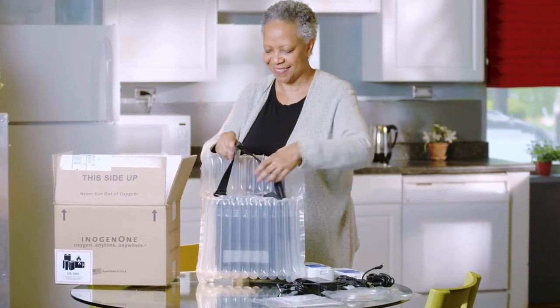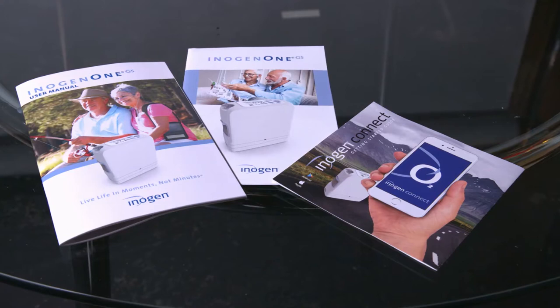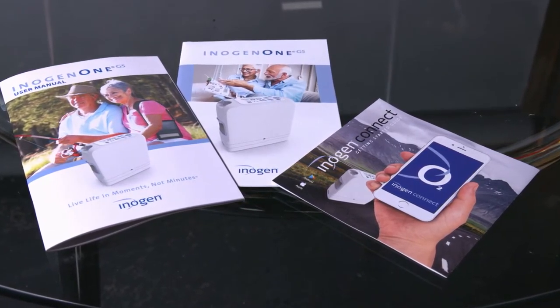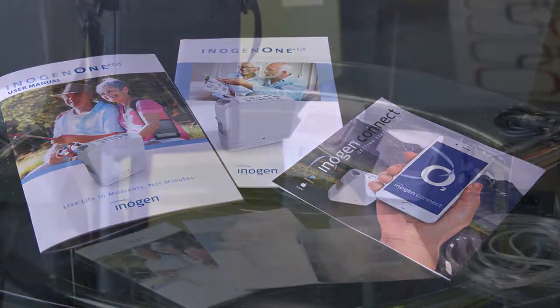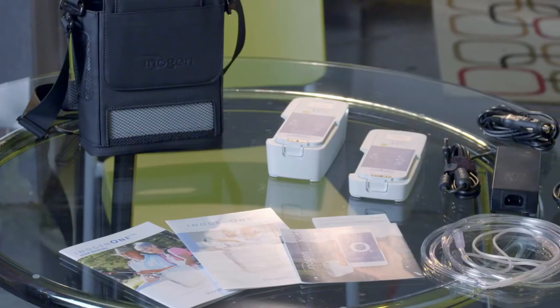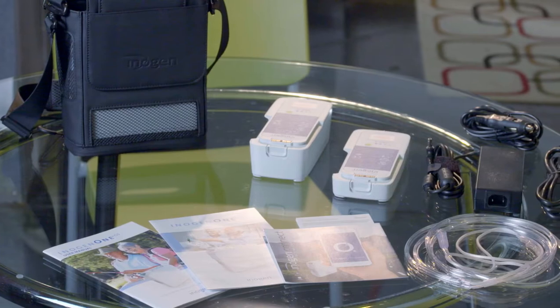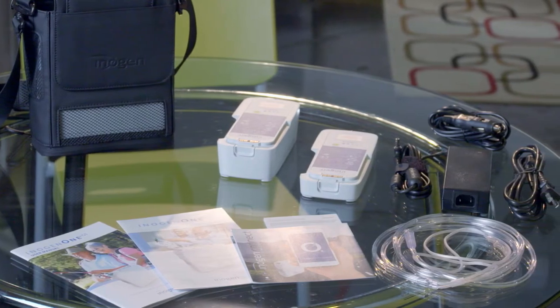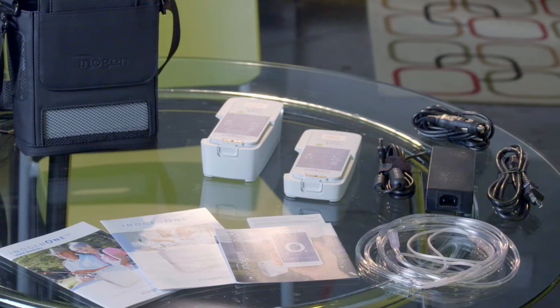Be careful not to throw anything away yet. Please read the enclosed Getting Started Guide and User Manual in their entirety before using the Inogen 1 G5. Now that you have unpacked all of the contents from the box, you have everything you need to get set up. Getting started with the Inogen 1 G5 is easy and requires no additional tools or expertise.